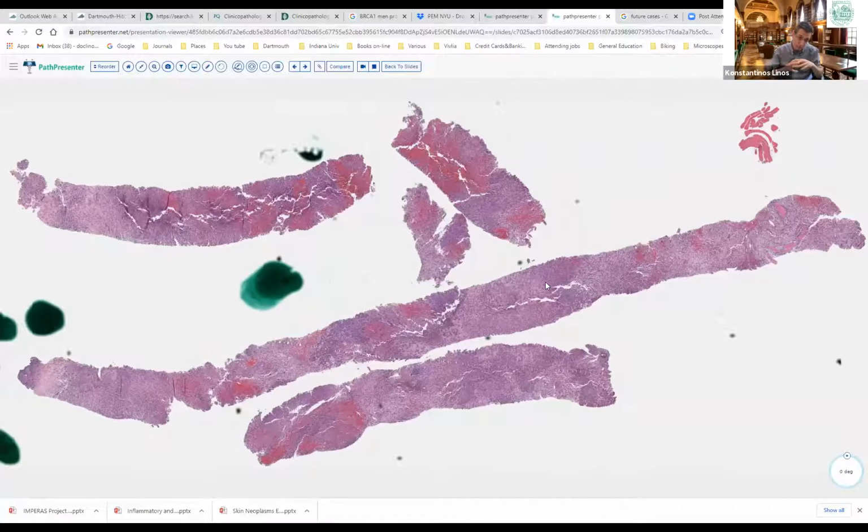So first of all, you have to check if there's history, because that's the cheapest way actually to make a diagnosis, and sometimes we forget to do that. So you could have no history, and it could actually be a primary epithelioid hemangioendothelioma, obviously with high-risk features, and we'll talk about this a little bit. I think it's a really nice case, because it kind of resembles carcinoma. It could have been keratin positive if you didn't pay attention to details. So always think about epithelioid vascular tumors in your differential.